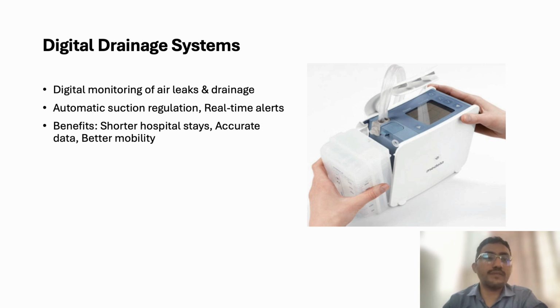The benefits of this system are shorter hospital stays, and accurate data can be taken of both air leaks and fluid drainage. And as these are battery operated, the patient has better mobility during the hospital stay.